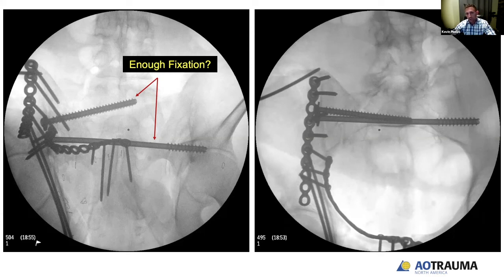I didn't personally think this was enough fixation given the amount of displacement. That's one of the things I wanted to emphasize in this talk. Historically, relying on one transiliac transsacral screw for this amount of displacement with this injury would probably have a high chance of ultimate failure.